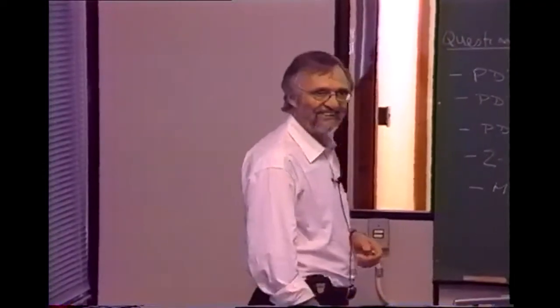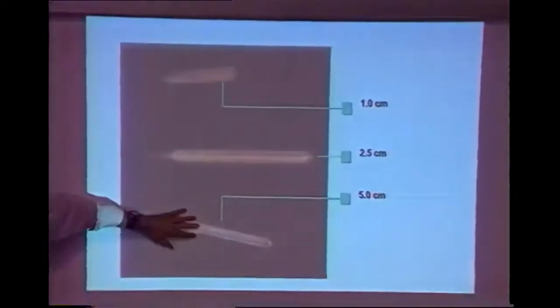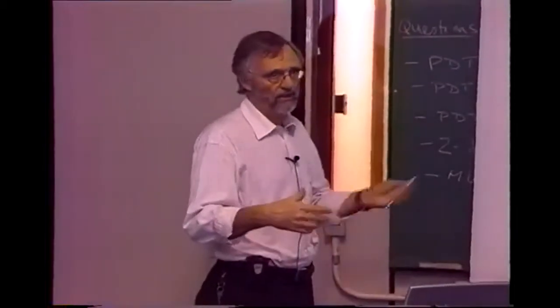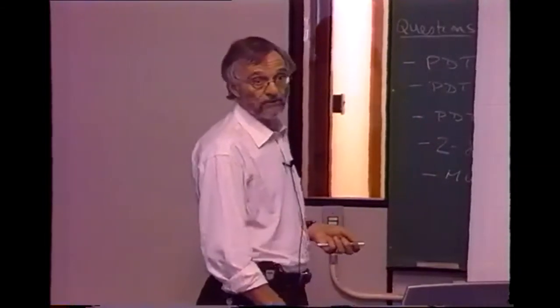We need a few diffusers here. Yeah. If you're making them for the lab, it's easy. The real cost here is to make these clinically approved devices. These have to be approved by the FDA. That means they have to have a certain quality standard. They're still too expensive, but I suspect if there was high volume and some competition, it might come down to $100, but it's not going to come down to $10 as technology. And often they're single use.